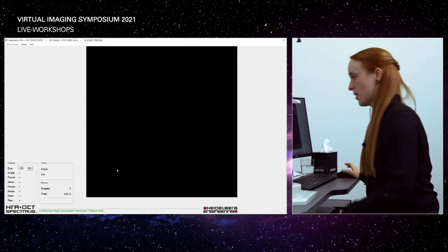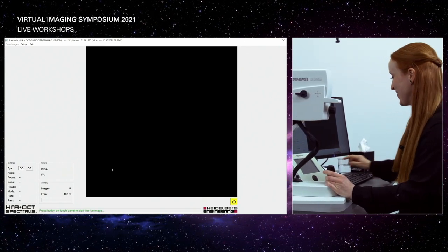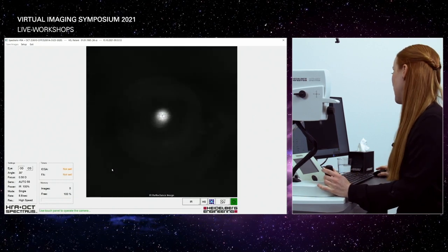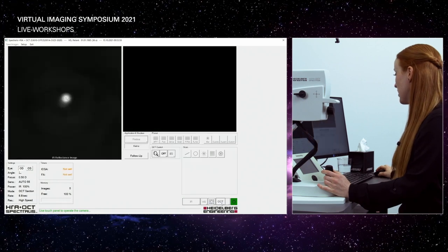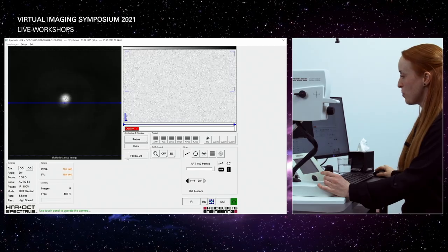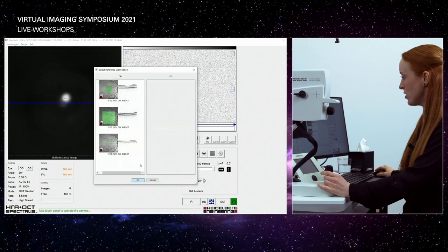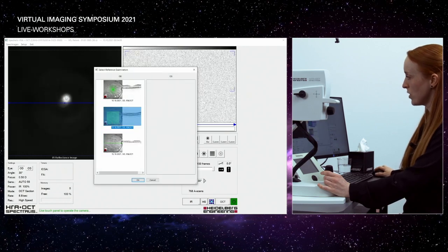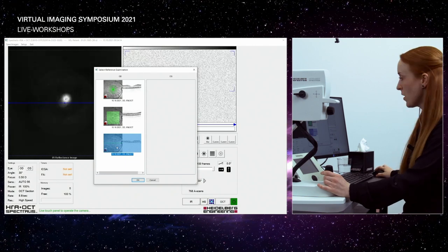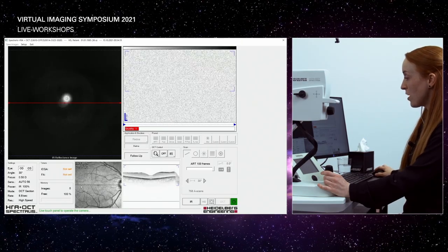So, just come back again. Thank you. And I'll activate the OCT again. And what we can see now for our patient, this button now is active, okay? And this is the follow-up button. So I'll push this and we see those three scans we did for the baseline visit, these are now available right here.